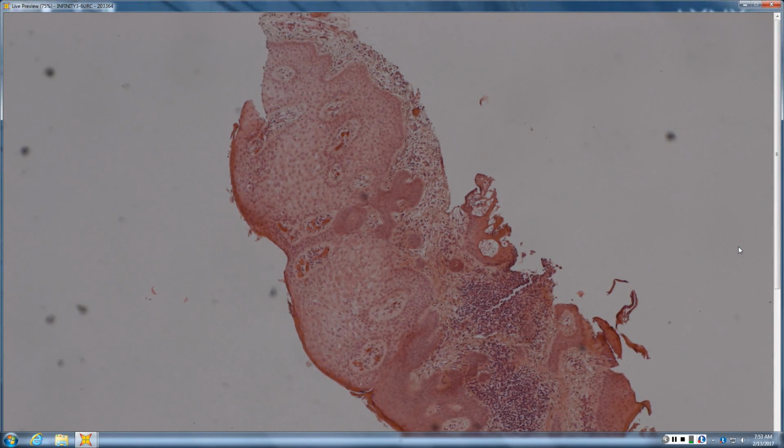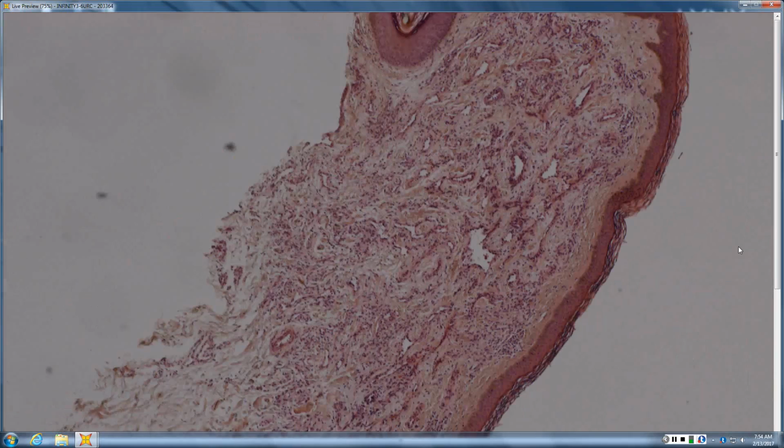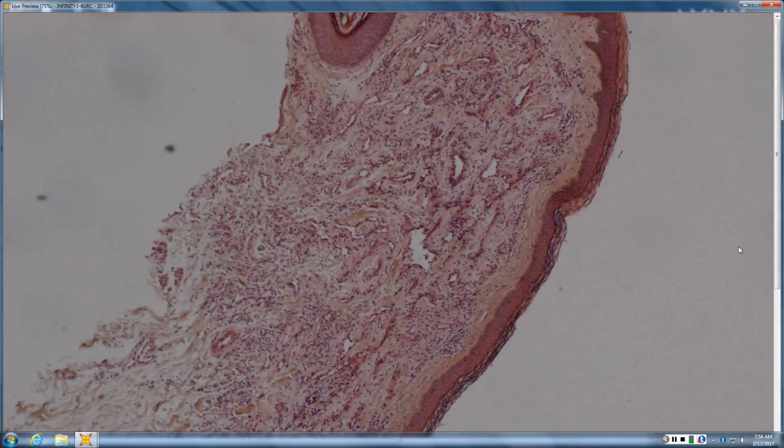It's the whole epidermis that's glycogenated abruptly, has a neutrophilic crust and neutrophil fragments and debris within it. A clear cell acanthoma. Absolutely. And I guarantee trichilemmoma would be on your pick list, right? So whatever you were thinking, it's there.